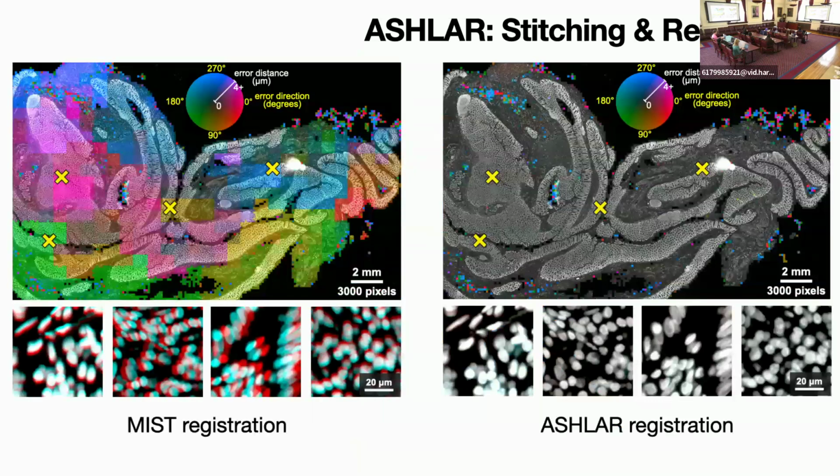This is a bit much, but I'll explain what these colors represent. The way we decided how well those 2 images lined up to each other, to see how accurate or consistent the stitching was, is through optical flow. But then we found out that all the standard optical flow algorithms crashed or used too much memory when you tried to run them on a whole slide image.